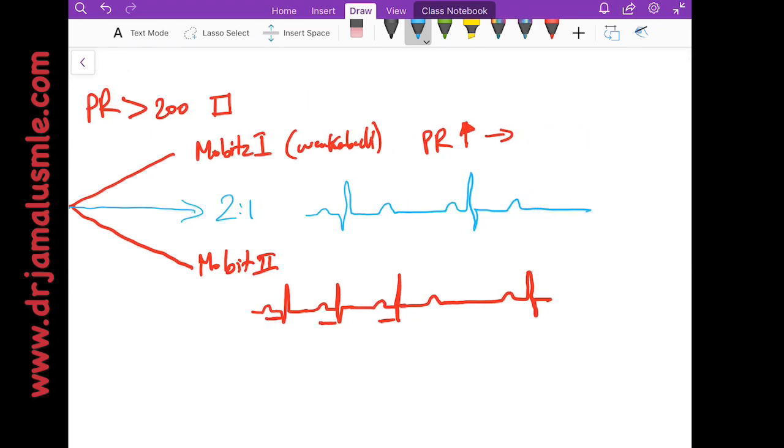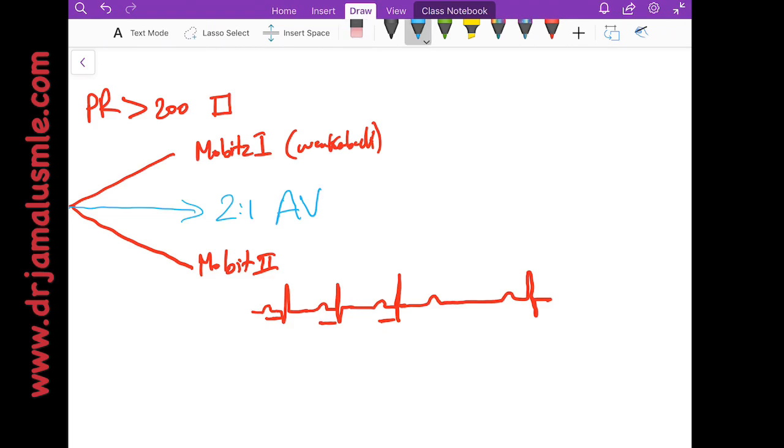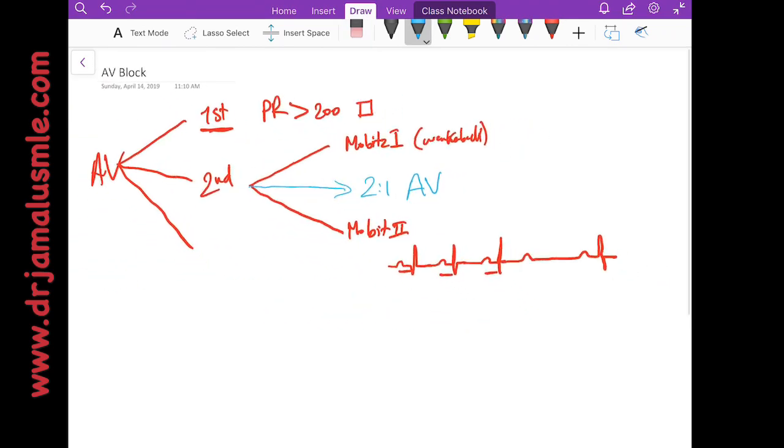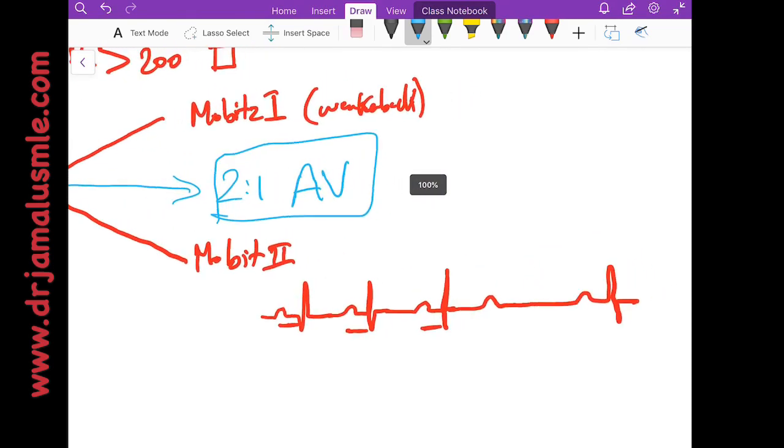Basically you can't know if the PR interval gets prolonged or not because you only have two P's and one QRS. You do not have the chance to see more P waves and to see how they conduct. So you literally cannot know if this is Mobitz 1 or Mobitz 2, and all you can say is that this is 2 to 1 AV conduction. Many people don't know about this and only a few books have it, and I think everyone should know that if you cannot differentiate between the both, it might be just 2 to 1 AV block.